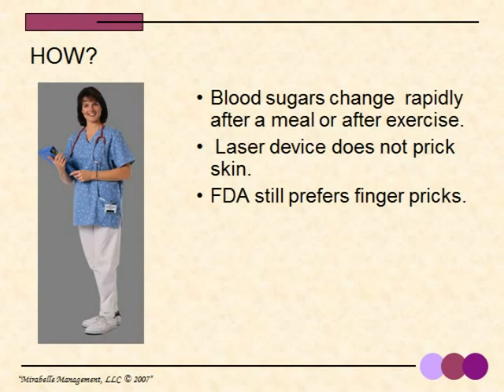In 1998, the FDA approved a laser device that produces a precise beam of light that penetrates the skin on the finger instead of pricking it. This causes less pain and discomfort. The FDA says newer devices should not replace the traditional daily finger pricks.